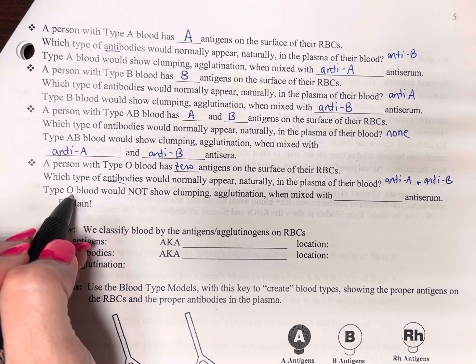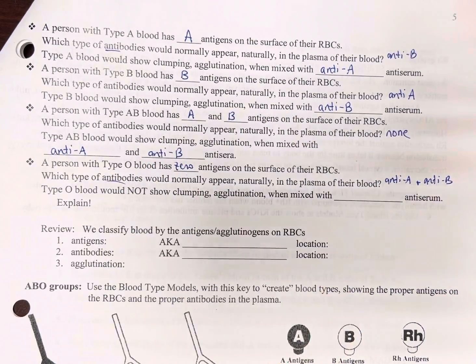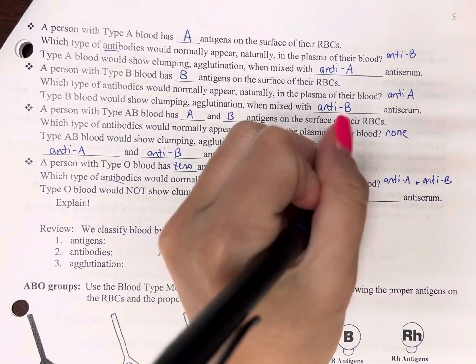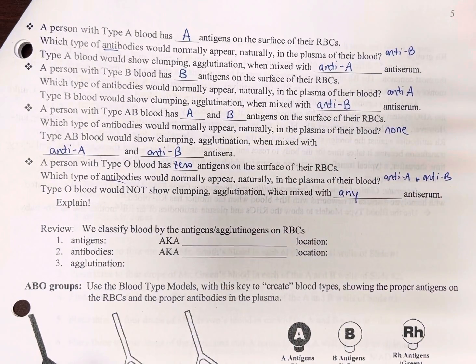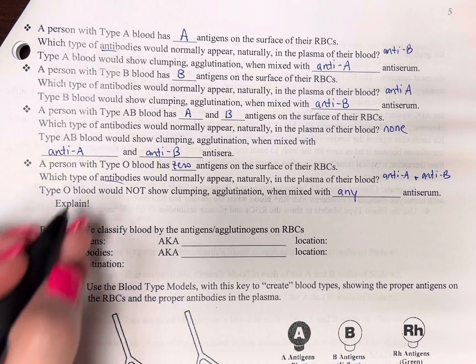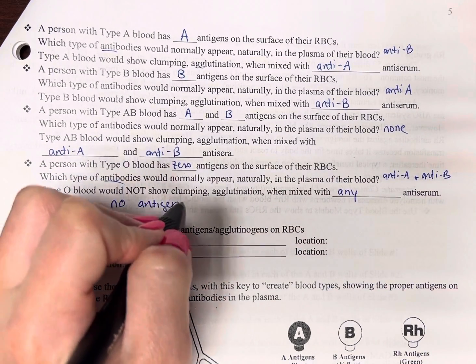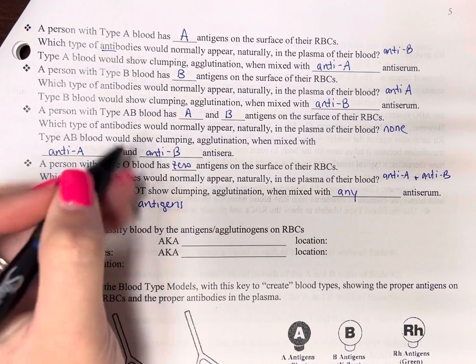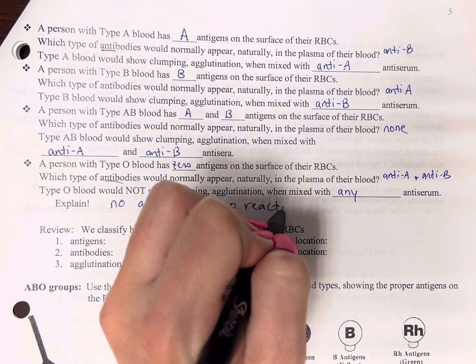So type O blood doesn't clump or agglutinate with any of the antiserums. Because remember, if you don't have any antigens to react with the antibodies, you're not going to get any reaction.